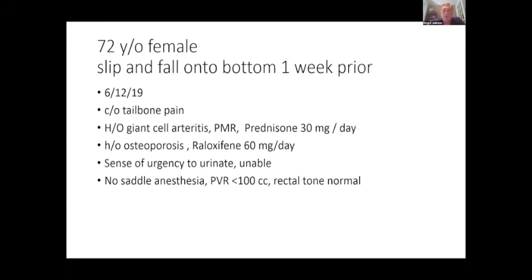And that last case, the one with just the symphyseal plate, that was the actual situation for that patient, where we washed out and repaired a bladder injury and then plated the front. And that was an acute emergency operation. And at that stage in my career, I wasn't quite ready to put in SI screws, and we just didn't get around to it. But I think it's something I would do now.